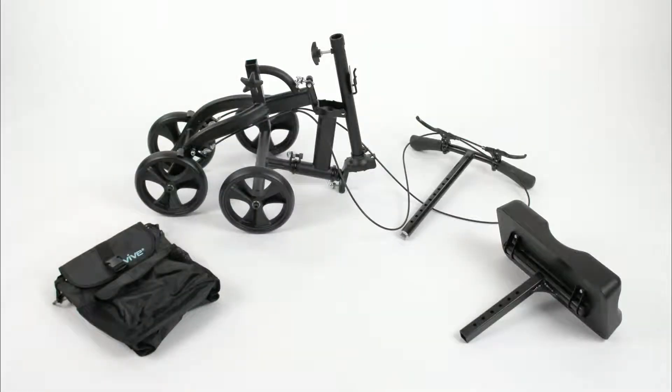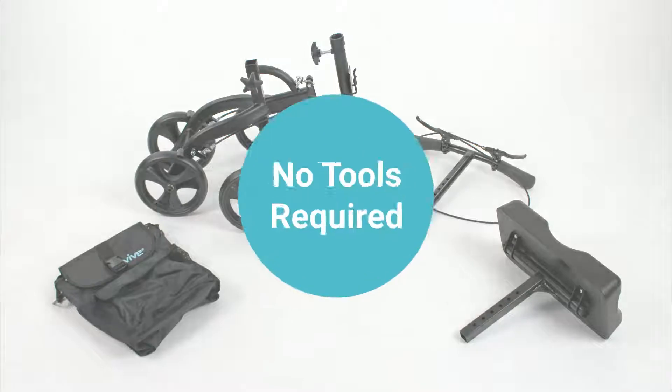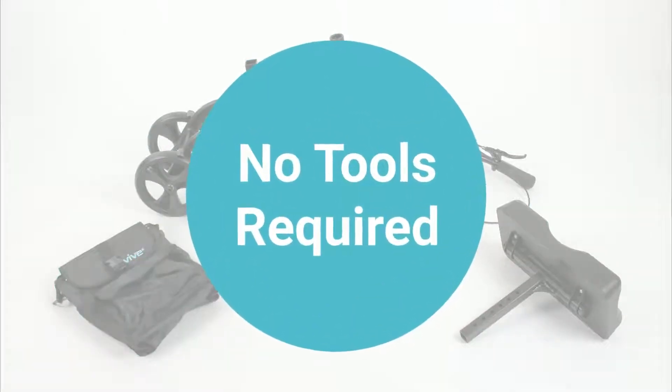Included with your order will be one walker with handles and wheels attached, one knee pad, one bag, two pre-installed adjustment knobs, one brake cable holder. There are no tools required for your knee walker assembly.